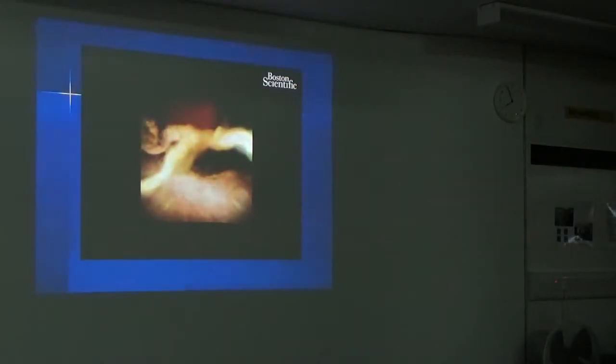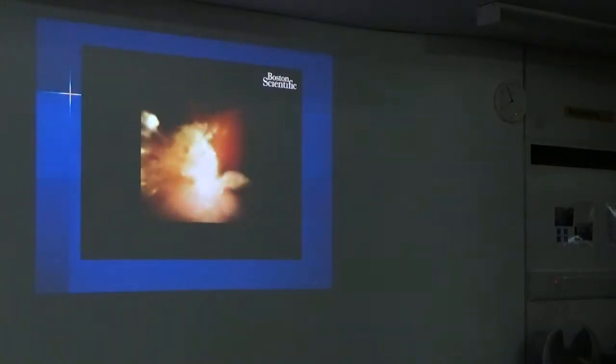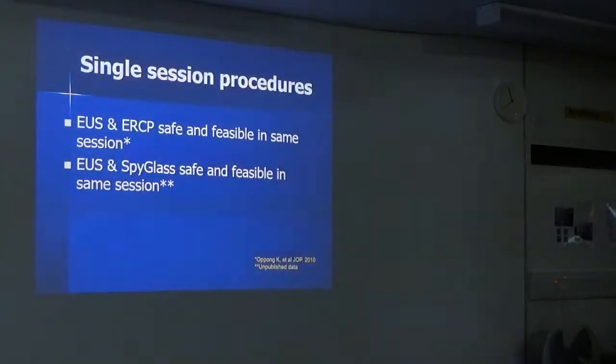This is actually a video of a procedure I've done, which just shows some stones, which you can see the little fragments there, and also a sort of irregular area at the top. We'll be able to get views of this that haven't been very well seen on external imaging, and then we'd obviously take biopsies as well as get rid of the stones that came across.